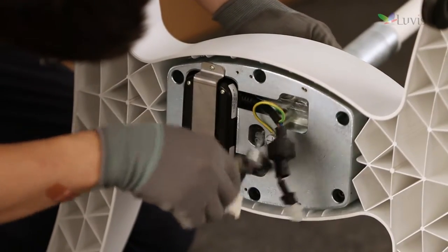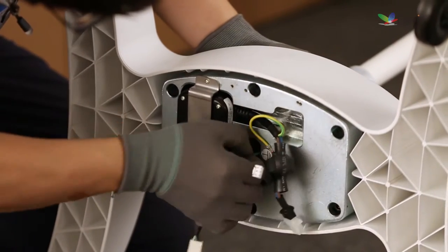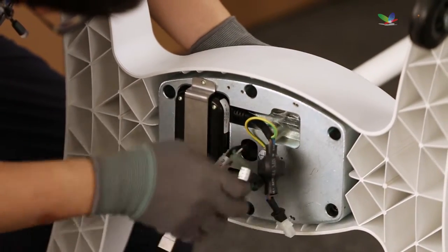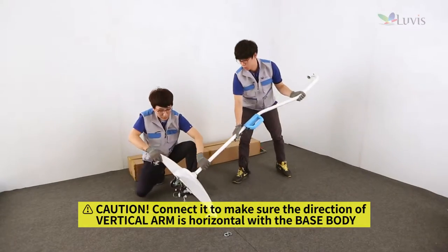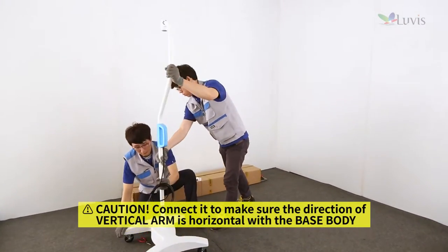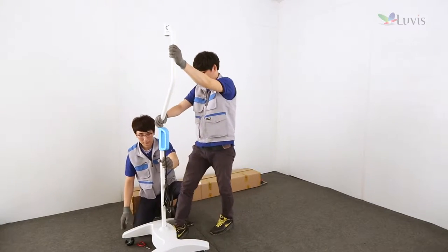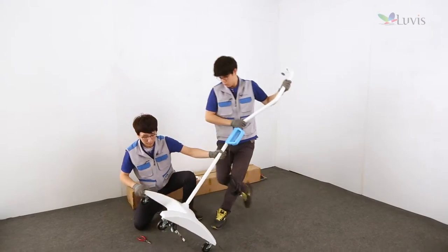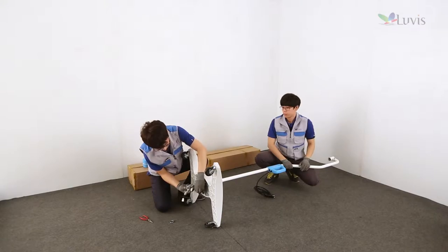Pull out the wire from the base body hole by using long-nose pliers. After completely pulling out the wire, clamp it to the base weight SMPS. Put the vertical arm straight again and completely connect it to the base body. Hold the vertical arm, tilt it to the side, and then completely lean the base body to the side where the vertical arm is connected.